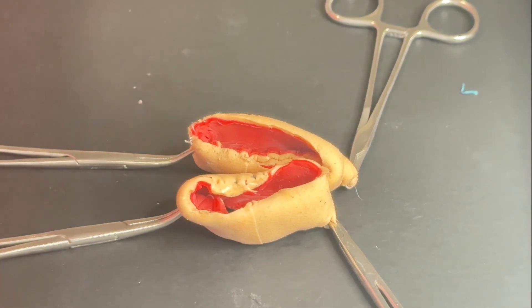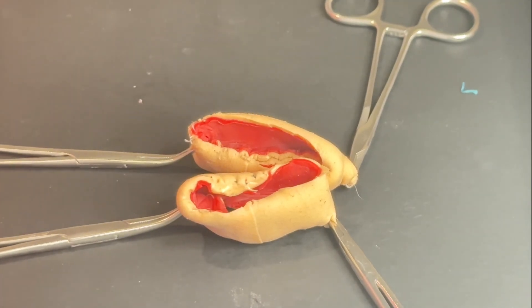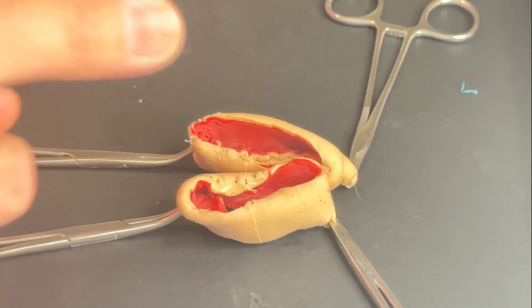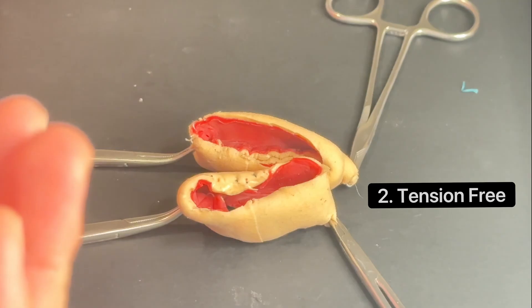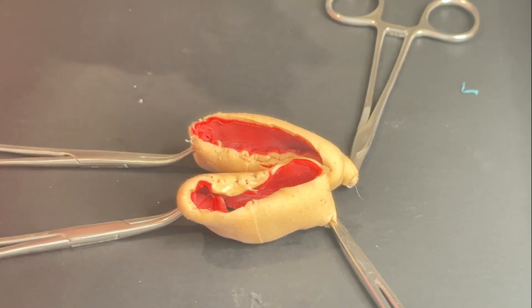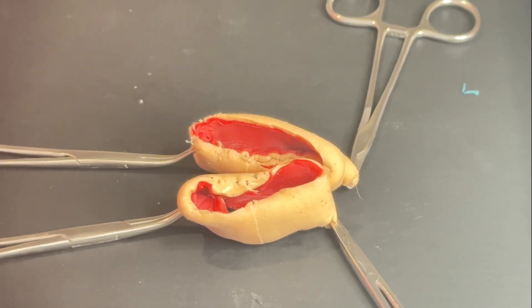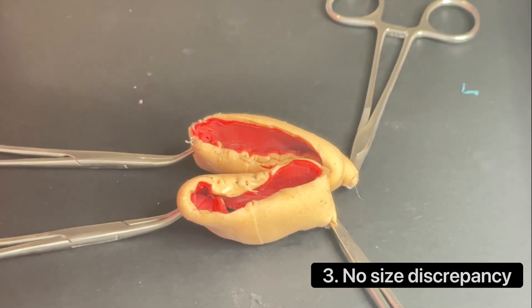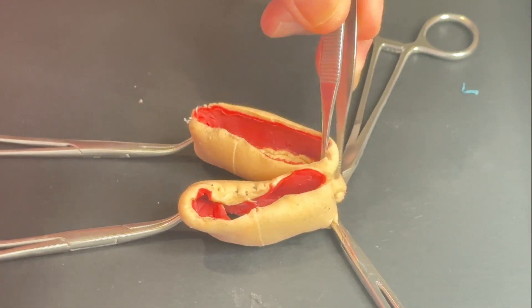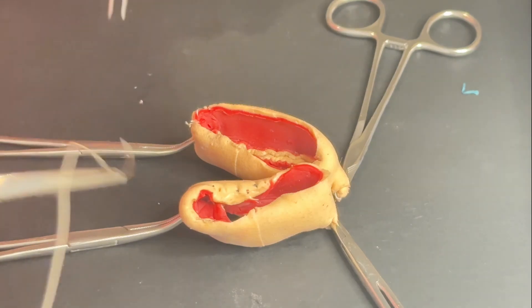Today we're going to talk about how to do a bowel anastomosis, and we're going to focus on doing a single layer hand sewn technique. The first thing you have to make sure is: number one, the bowels you're putting together are healthy. Number two, it's tension free — not under tension. If you need to mobilize more, then you have to, because suturing under tension will eventually break down. Number three, make sure there is no size discrepancy — they should be pretty much equal in length and width.